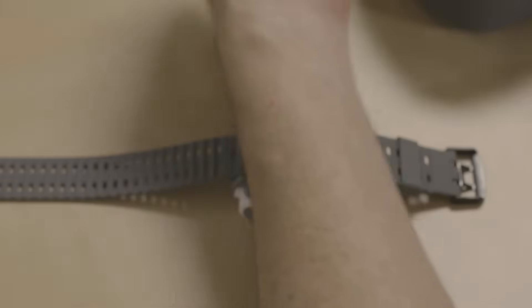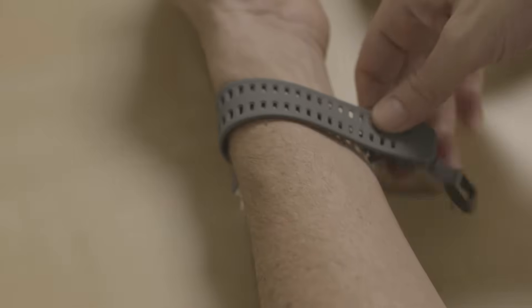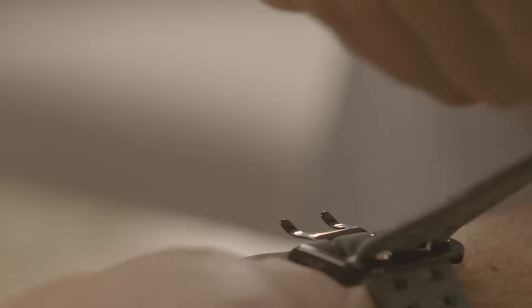Place the WatchPad on a flat surface. Insert your hand and close the wrist strap, making sure it's snug but not too tight.